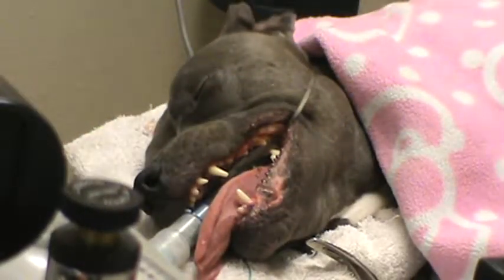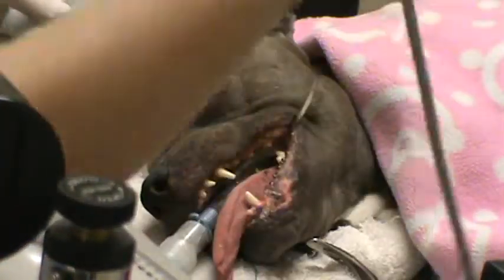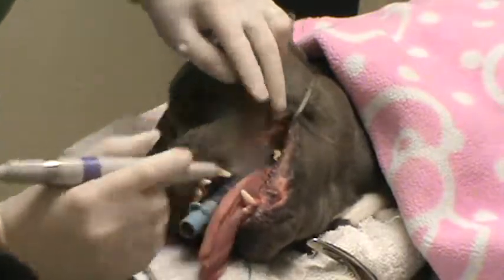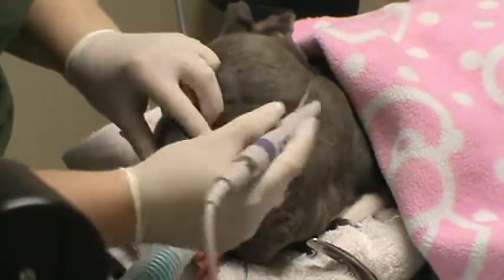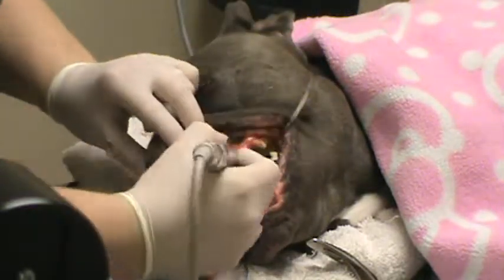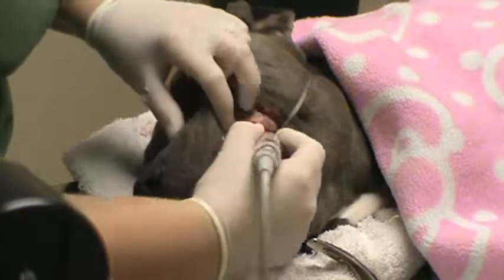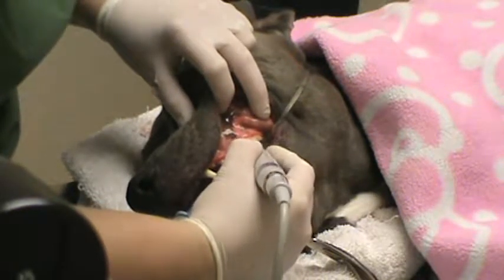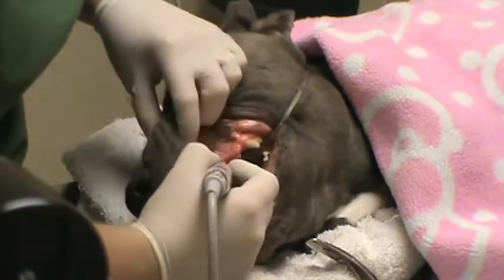For the next part we're going to go ahead and use the ultrasonic scaler. With this you want to make sure that you don't touch each tooth longer than about 10 to 15 seconds, and that you're only using the side of the scaler and not the tip. You're also not using this subgingivally. If you have to keep using it, just go to a different tooth and come back to that tooth.